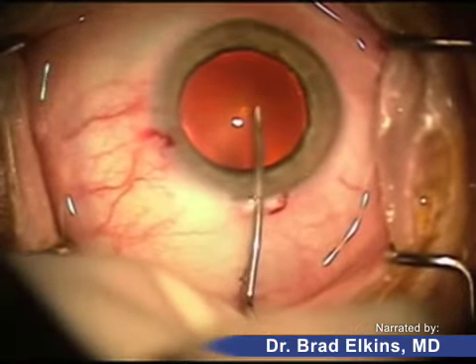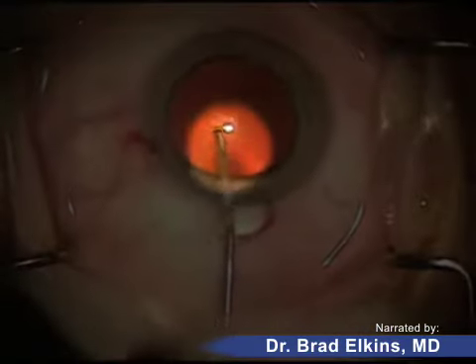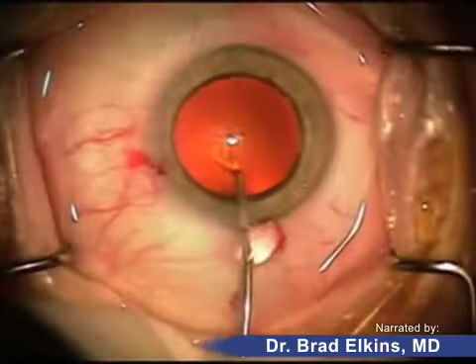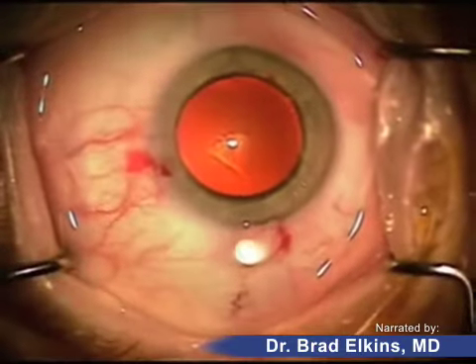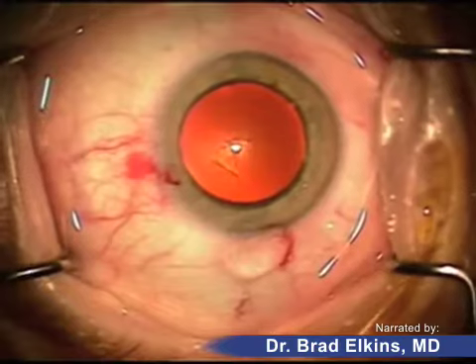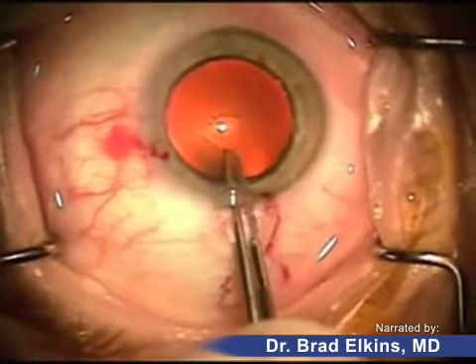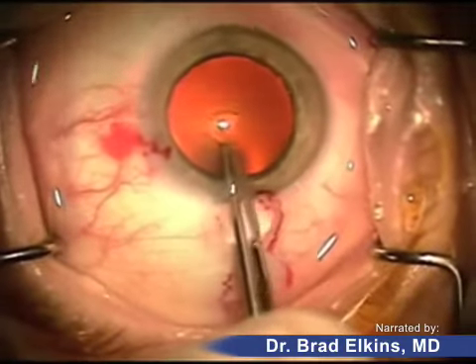This is a special type of needle which is going to make a small tear in the front part of the lens called the anterior capsule. As you can see, the tear is being extended. Next, an instrument is going to go into the eye to make this into a continuous curvilinear fashion — basically a circular opening in the front surface of the lens.